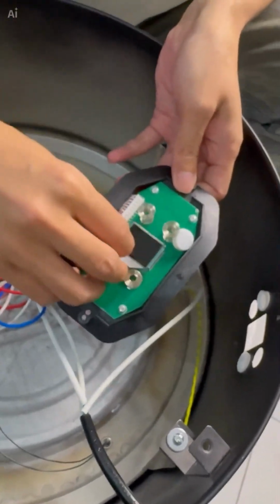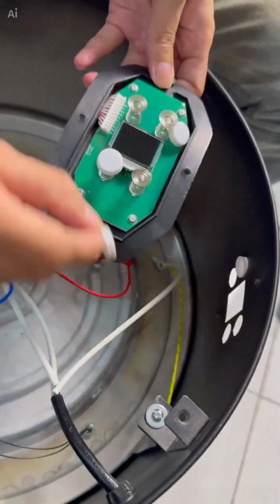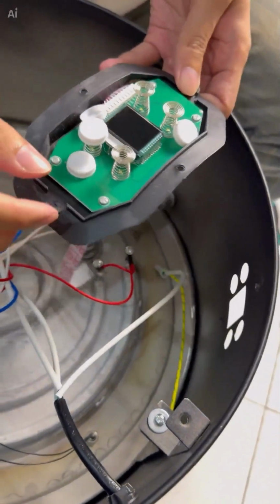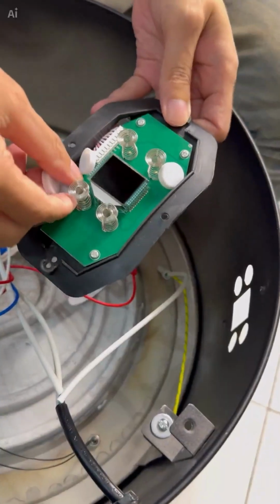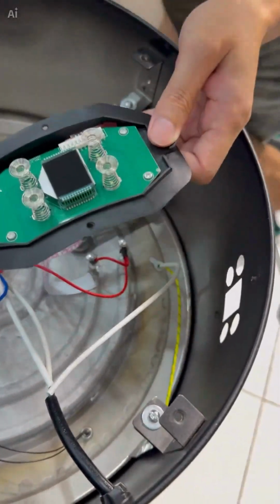Come, remove this. This is the keycap, and here there are 2 more keycaps. Also take them out. Okay, these are all keycaps. After removing them, these keycaps are not needed, so put them aside.